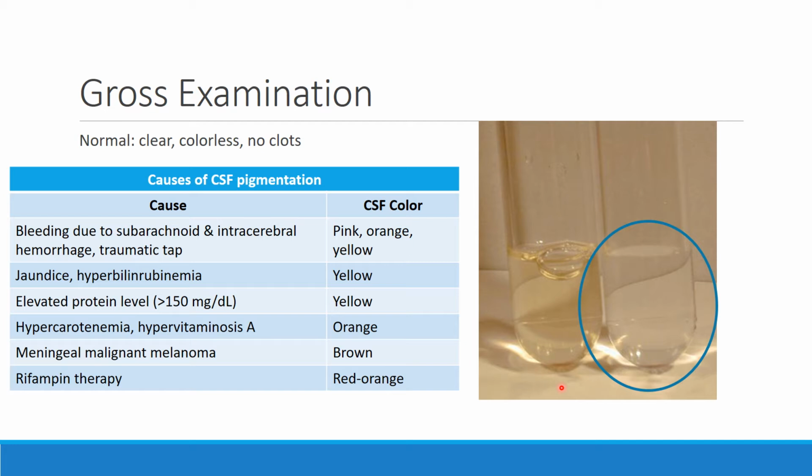Okay, this is a sign of the presence of either blood or hemolyzed blood or old blood. So you might find xanthochromia in particular in cases of hemorrhage. For patients who have had a hemorrhage in the past day or so, frequently we see xanthochromia in the specimen. Color can also be found with various other situations, and this little chart gives you the reasons for that.